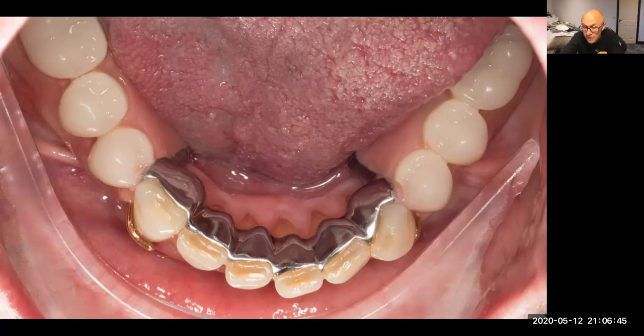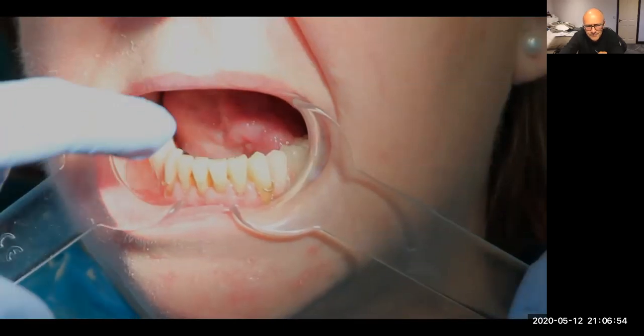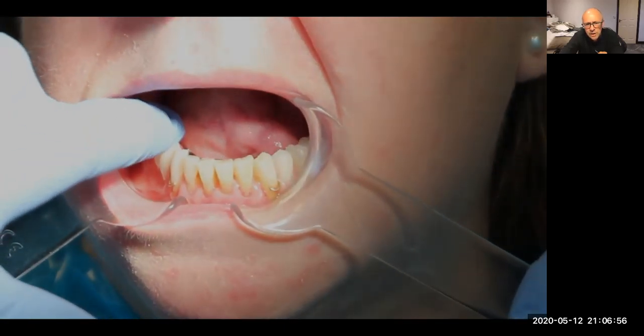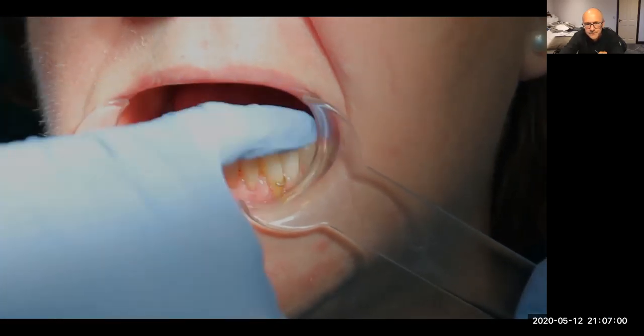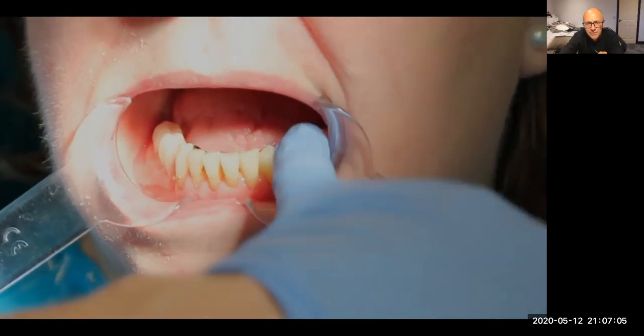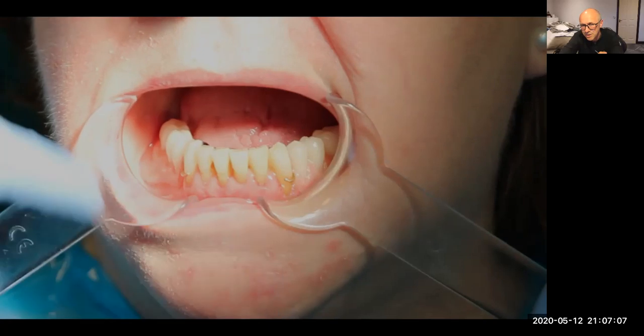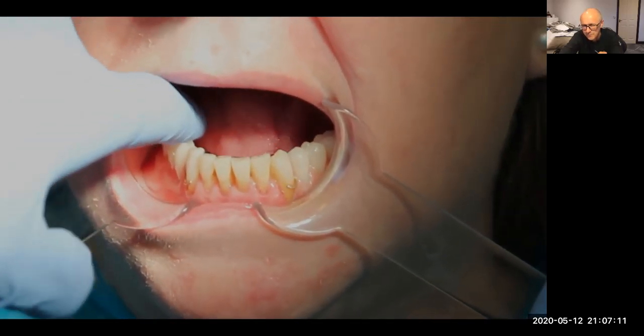If I have a preference, I do want to have a connecting bar though. I do want a lingual bar really. But this is her denture in place there. And, you know, it works really, really well. It's solid and firm. Beautiful. So no movements on that at all. And this is down to extension of saddles and great tooth support.